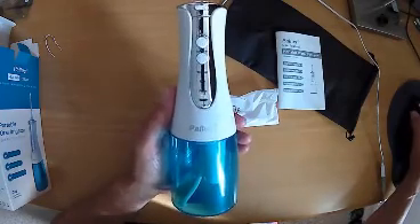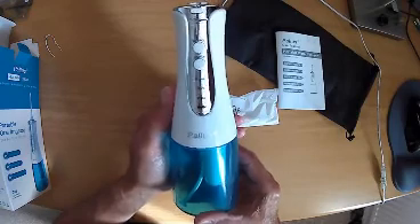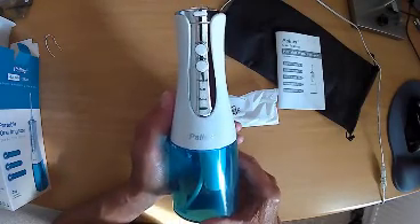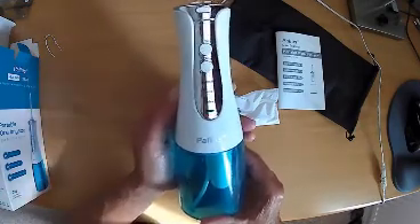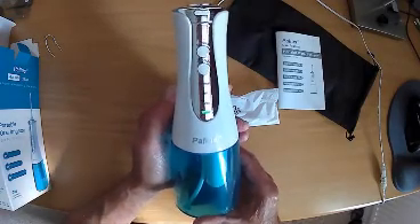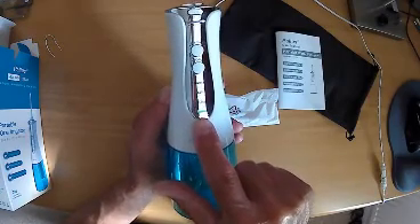This is the base unit being charged. It's recommended that it's given a full charge before use, and it can take up to five hours to charge fully. The flashing light indicates charging.